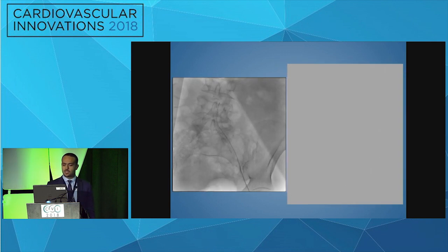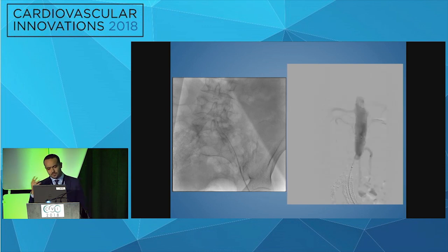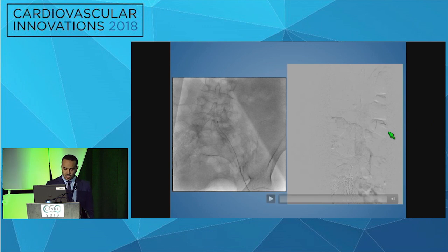So we tried to wire it with a Wooly wire, and you see how the Wooly is buckling in the stents. A few things went through our minds: is it the interaction with the stent struts, or with a luminal thrombus, or maybe is it running behind the stent? We were able to come up with a catheter, and the aortogram confirmed that we're actually luminal in there.